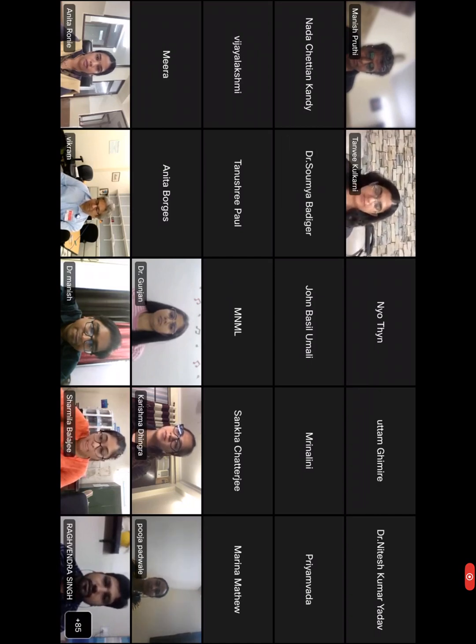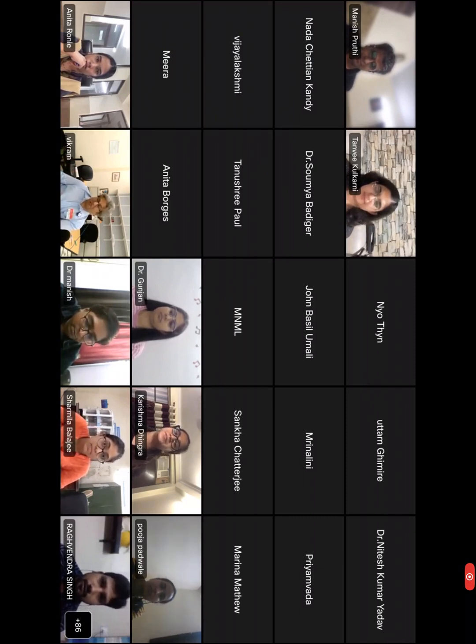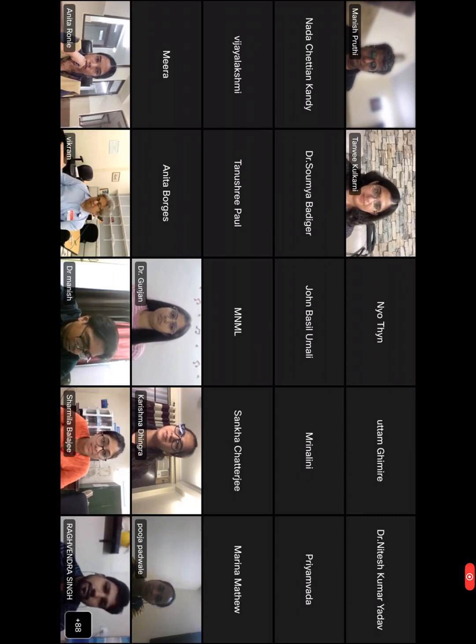And the other thing is, my approach generally is I always start by looking at the slides under the microscope and then walk across to the radiologist. For example, we had our tumor board this morning, and I'll stop the radiologists and ask them as they show slides. So we have quite a conversation. Occasionally, if it's a longer conversation, I'll actually go down to their office, or we do it on Zoom, of course, these days. Sometimes they'll be able to tell you what it is, like fibrous dysplasia, this is ground glass, this is fibrous dysplasia. And I'll tell them, look, I don't have it under the biopsy, but it's probably fibrous dysplasia, or perhaps there's a little bit of tissue.